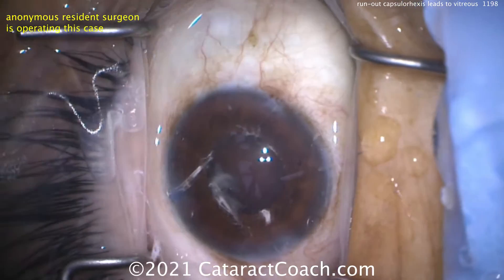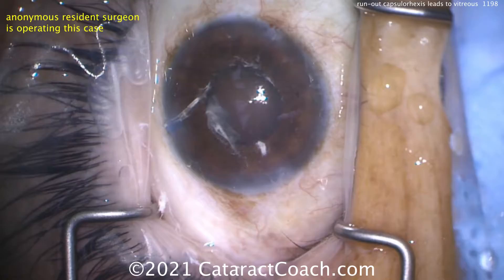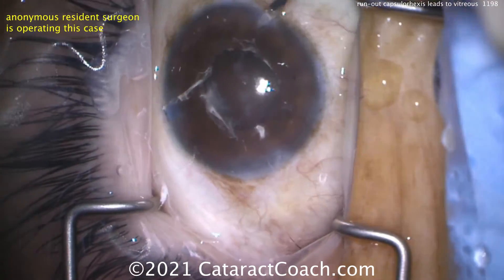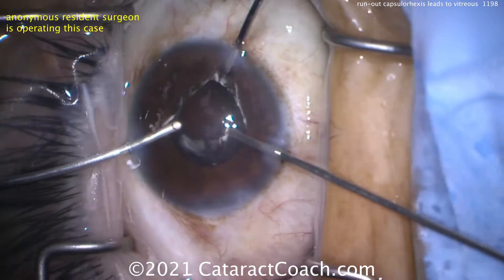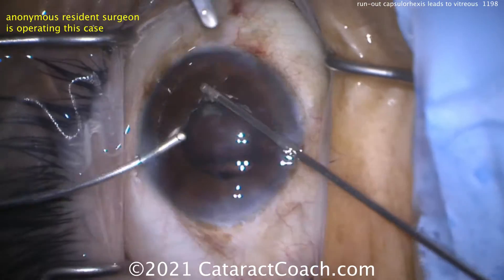We're going to do a bimanual 23-gauge anterior vitrectomy. You can see all that white is the stained vitreous with the triamcinolone. Making the paracenteses slightly wider — there are now three paracenteses, or TC incisions — that gives great access. Infusion goes in one, and then the cutter in the other, bringing those pieces down.